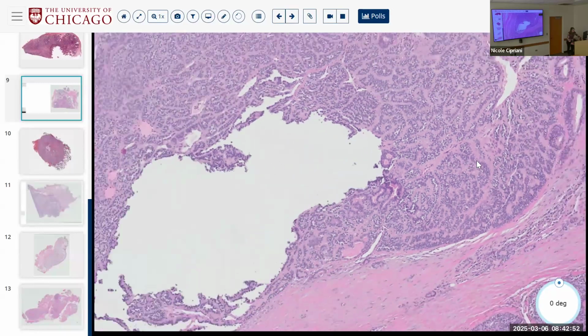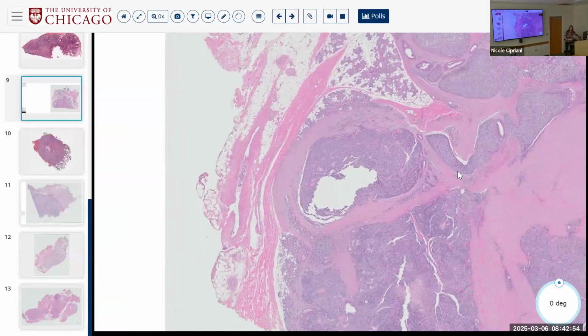Okay, so now what's your differential? So biphasic, at least based on H&E, which is true if you do the immunostains. Infiltrative, differential. What are our infiltrative biphasic tumors? We already saw one of them, adenoid cystic. Does this look like adenoid cystic overtly? No. All right, what else?